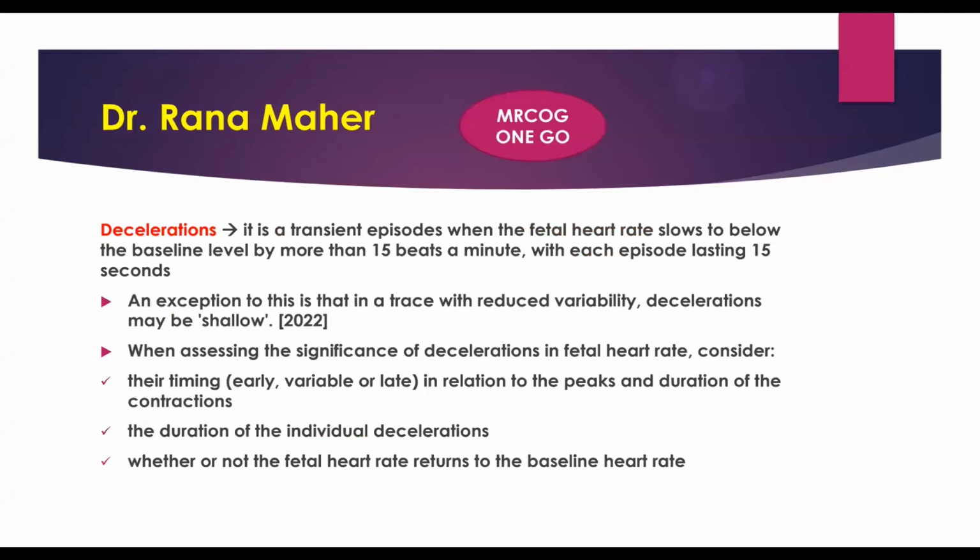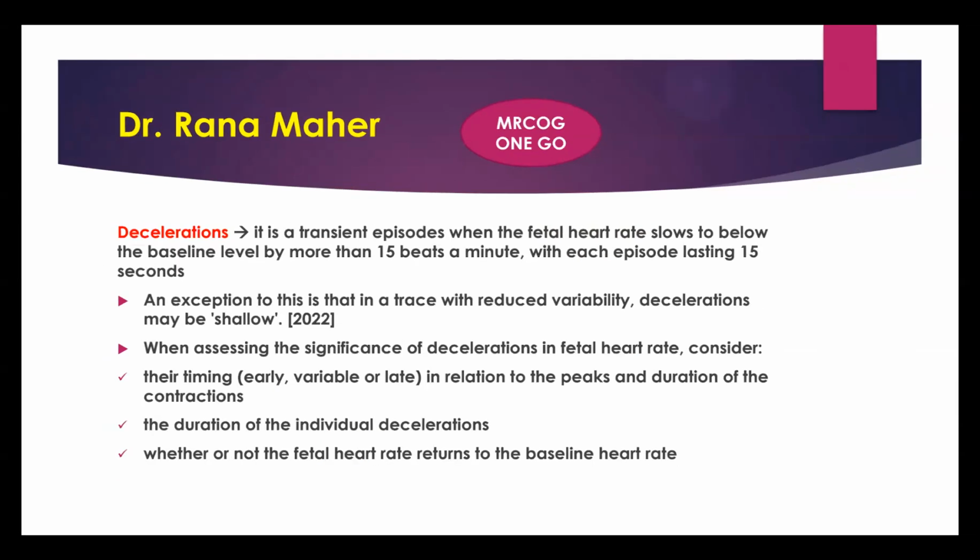Our next feature will be the decelerations. It's a transient episode. So what about the definition of the decelerations? A deceleration is a transient episode when the fetal heart rate slows to below the baseline by more than 15 beats per minute, and this will last for 15 seconds. So it will go down 15 beats per minute and last for 15 seconds or more.